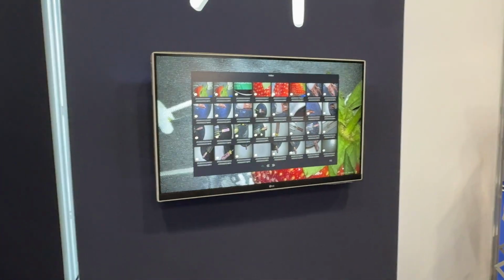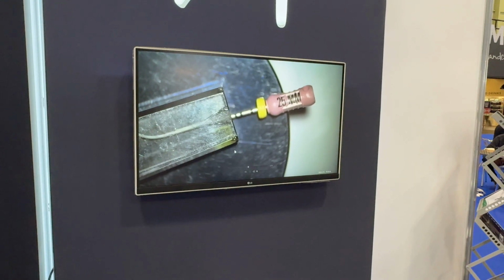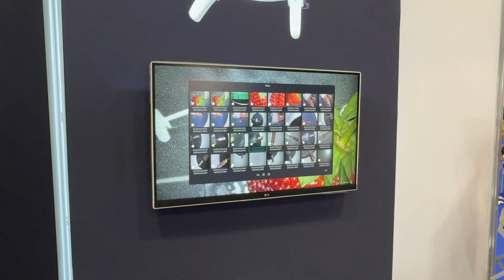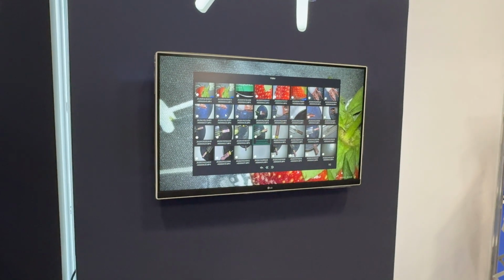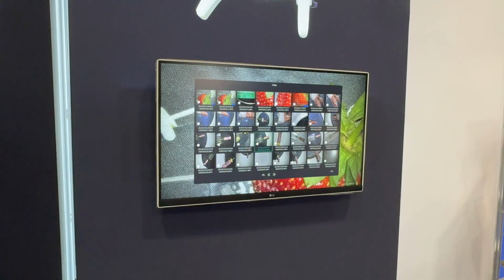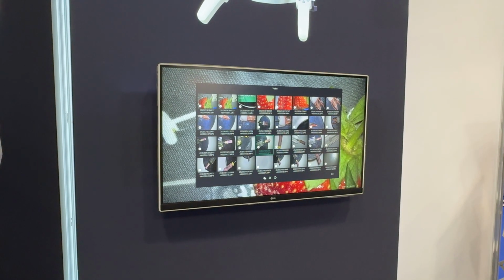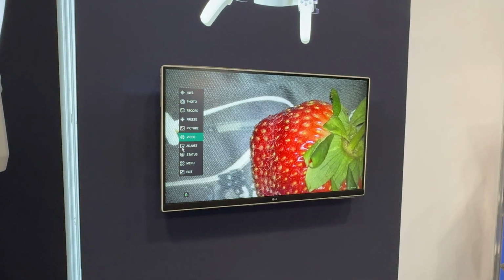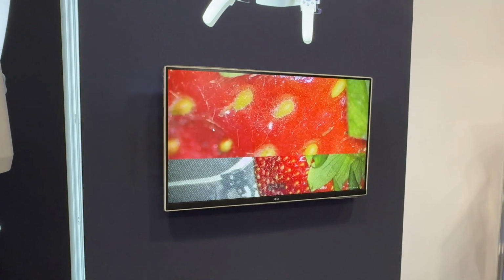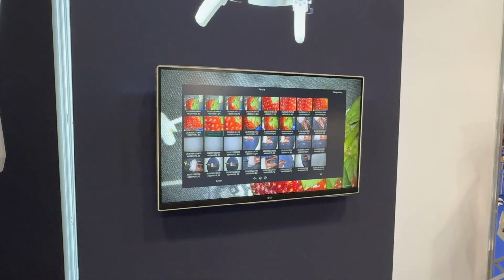Do you know what I like about there as well? You've got a split screen, haven't you? So you could have one half of the television with the picture you want, and then you've still got the video on the other side, so all of those different videos that we've taken. And if you wanted to come out of there, you go back, and then you go to the pictures, and that last picture that we took, and that'll give you all.